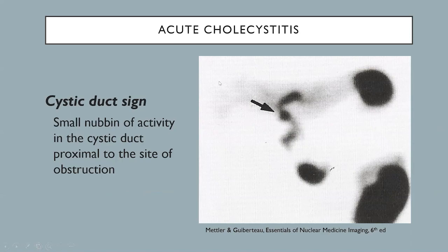This is another case of acute cholecystitis where radiotracer activity from the liver has already progressed into the common bile duct, and much of it has excreted into the small bowel. There is a nubbin of activity in the cystic duct proximal to the site of obstruction — this is the cystic duct sign associated with acute cholecystitis.